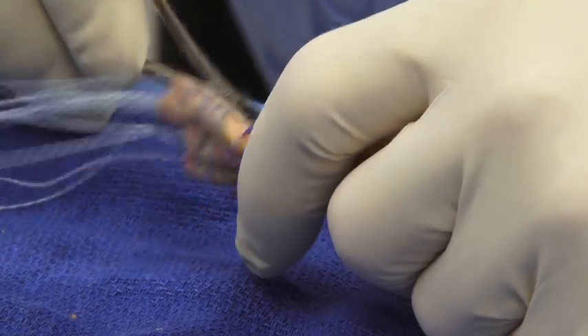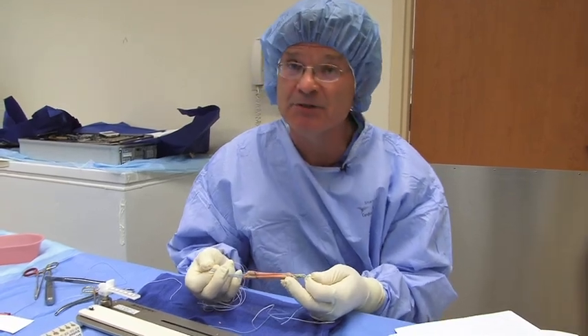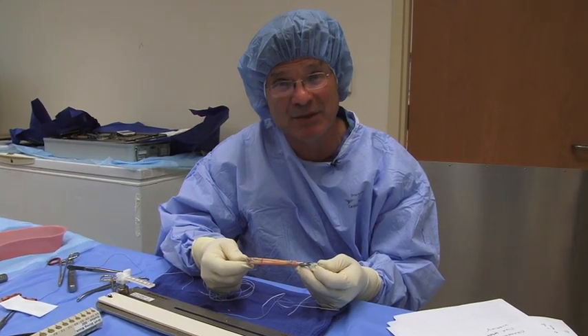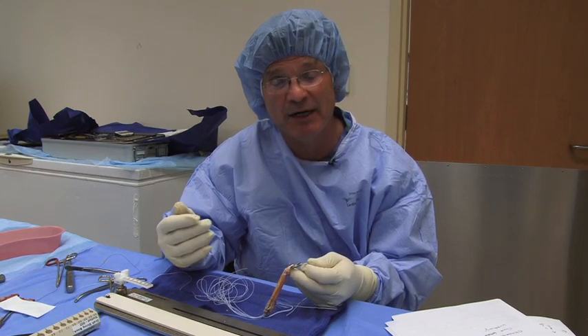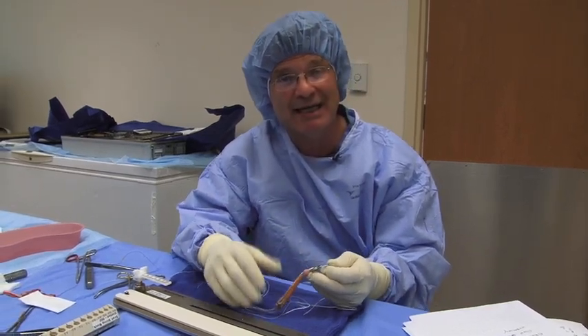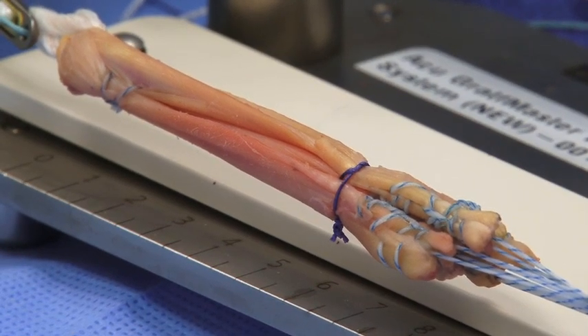This is a hamstring graft for ACL reconstruction. What you want is as much biologic material in the graft as possible, but you also want graft in the tunnel so that it can heal. This method allows more graft length. Some people use a single tendon folded over, or quadruple a single tendon, but that leaves a very short tendon, whereas this leaves more length in the graft and the tunnels. Utilizing this method, we typically have a graft that is 80 to 90 millimeters in length, circumferentially 8 to 10 millimeters on the femoral side and 9 to 11 millimeters on the tibial side. This typically enables us to use a 10 millimeter suspensory button, giving near complete fill with the graft in both the femoral and tibial tunnels.